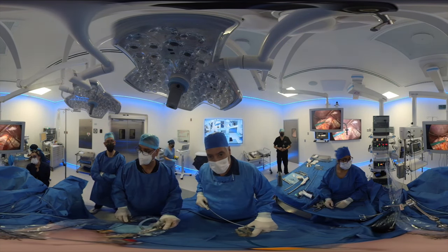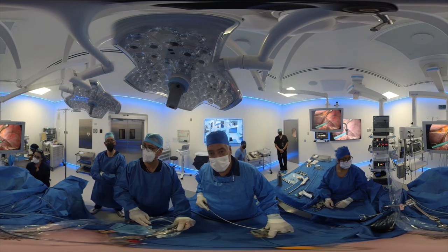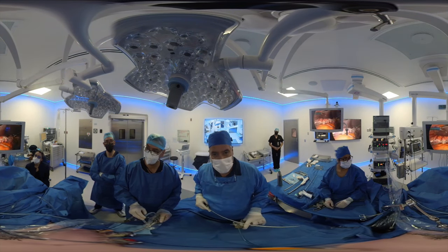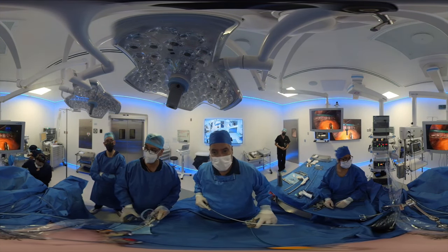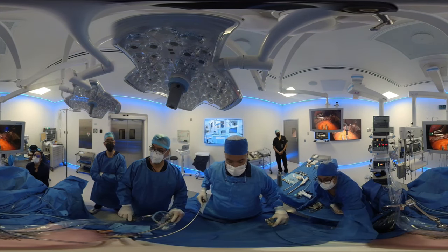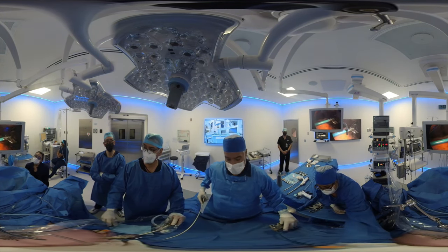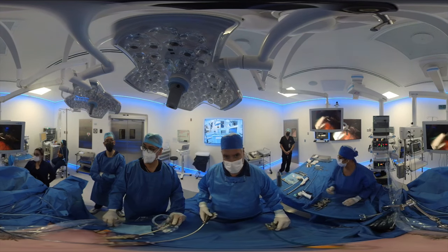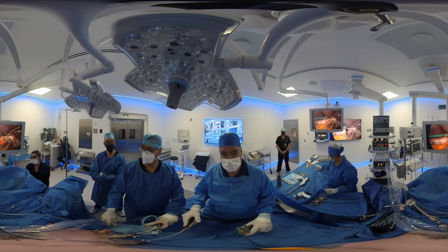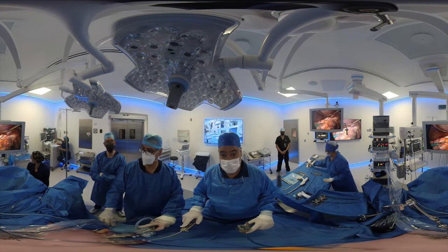The stomach comes from up here where it joins the esophagus. You can actually see the heart beating through the diaphragm — that's the heart beating, a beautiful sight. This is the liver, and we're raising it with a liver rod, a metal rod. And then this is the furthest part of the stomach all the way into the intestine. This beautiful structure here is the pancreas. The pancreas is one of our organs essential to digestion and metabolic processes — a very important organ. It resides behind the stomach, so it's extremely well protected.